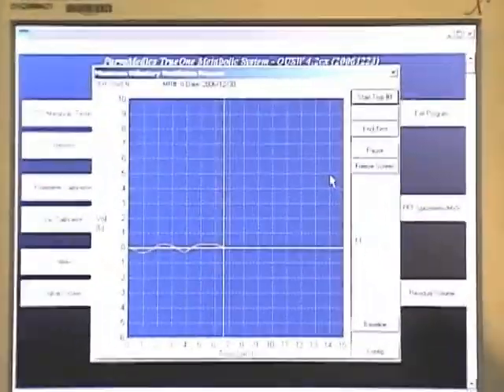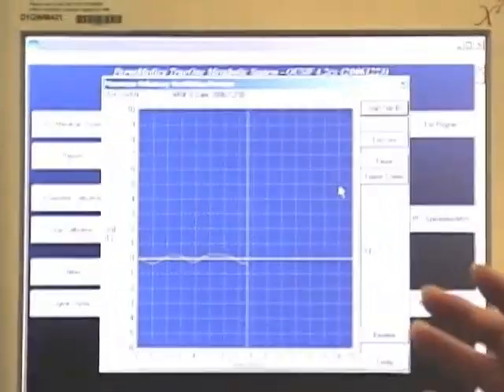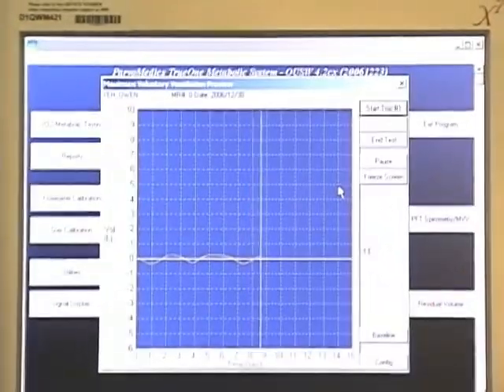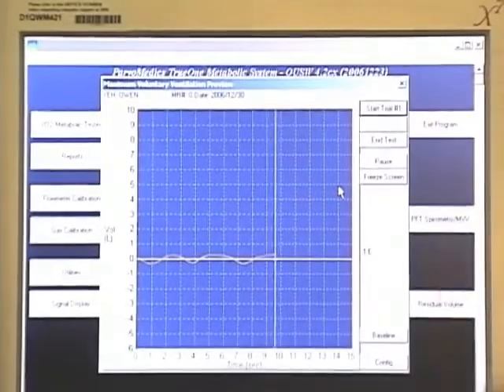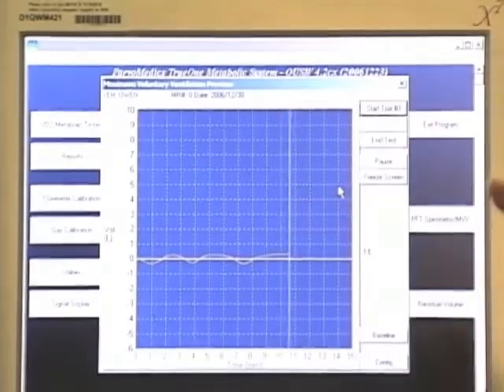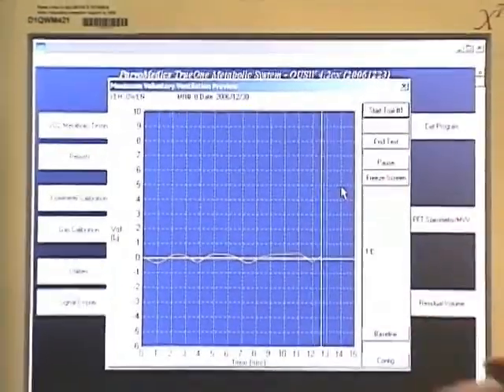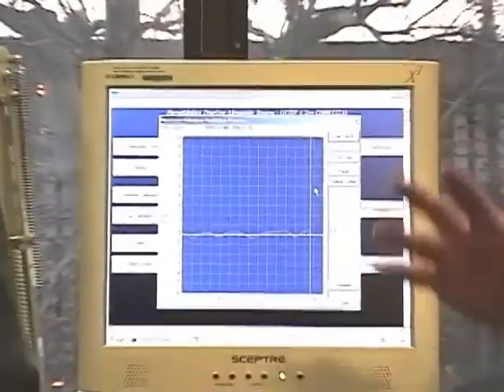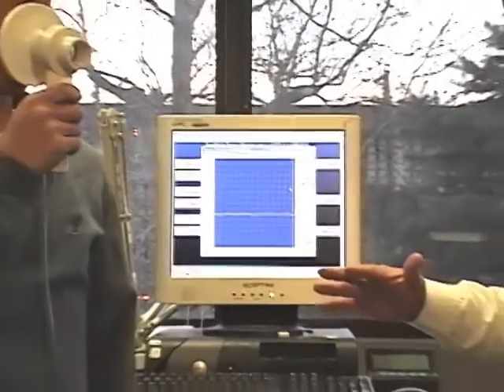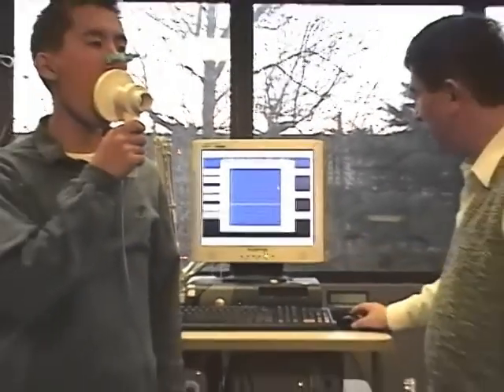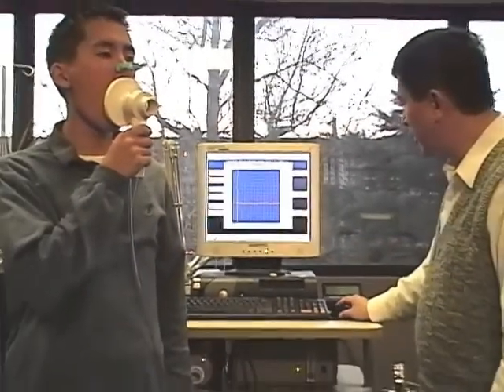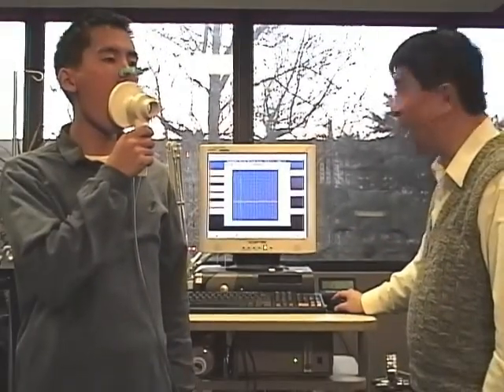So when I say start, you should do your maximum voluntary ventilation — as deep and as fast as you can. OK, start.